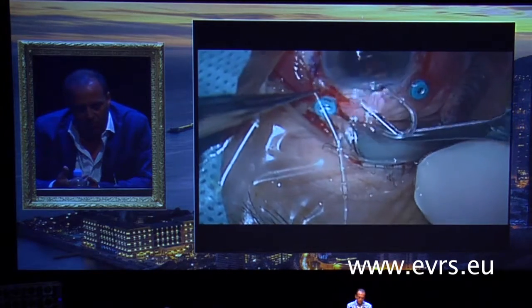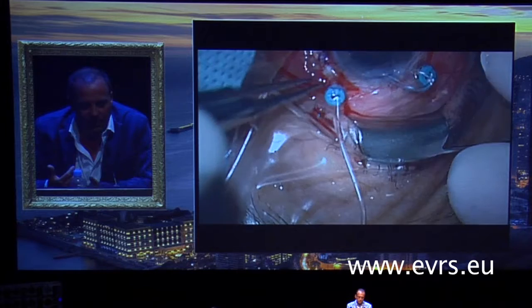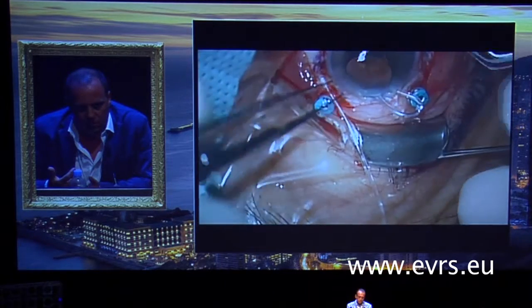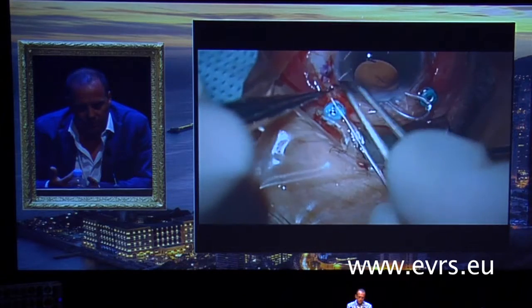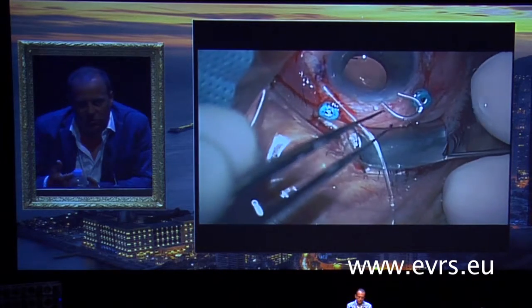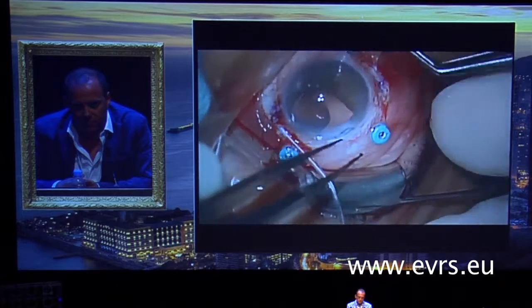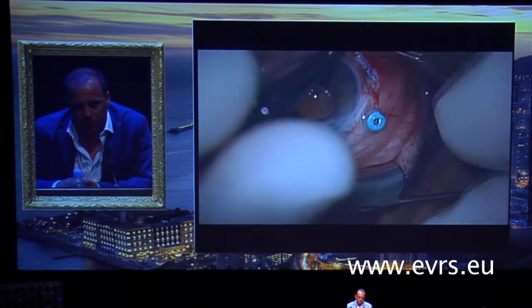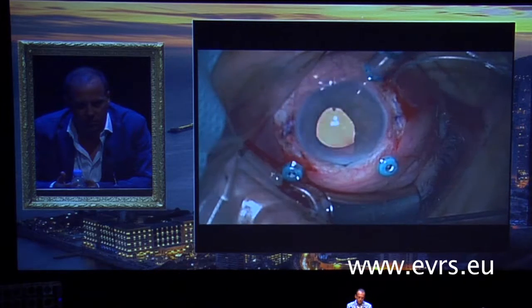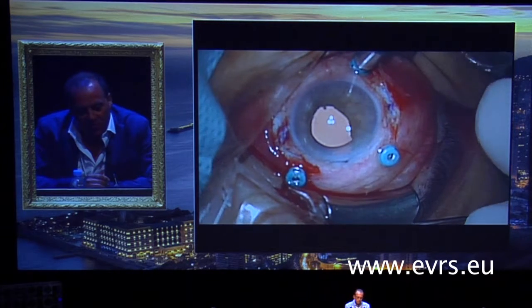So it's a funny way, a different way. As you know, the IOL in the sclera is very stable for years. So one, and two, on the other side. And once the haptics are in the sclera, you just remove the tubes and the surgery is finished. Okay, you can center now and control. Okay, you just remove the tube and the haptics are in the sclera. This is a different way that is quite funny to do.